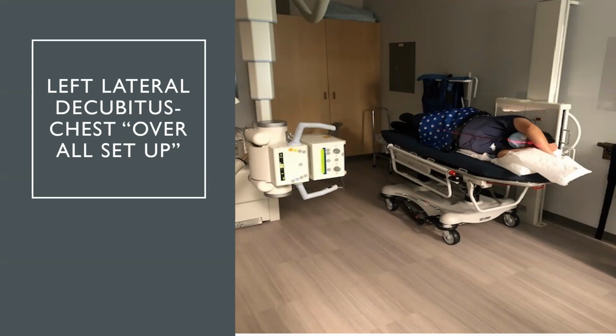Patient position. Patient is recumbent and lying on top of the radiolucent pad on their left side, facing away from the IR. Back is against the IR and the patient's arms are above the head. A pillow is underneath the patient's head for support, and the stretcher is locked in place.